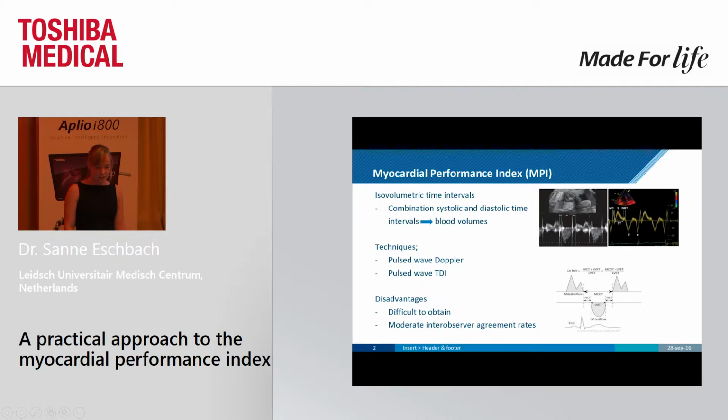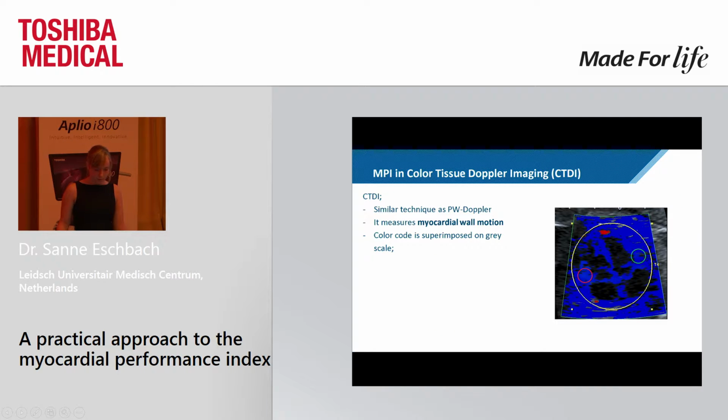Disadvantages are that it's kind of difficult to obtain, especially for ultrasonographers who are not doing it daily or not doing it often. And it has only moderate inter-observer agreement rates. So that was why we were searching for another way to assess cardiac performance of fetuses.